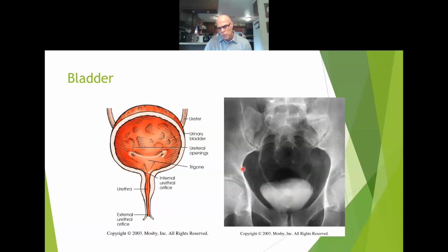So that's what your image would look like. It'd be about 3 inches above that. So you'd be centered right there, and you'd get this entire obturator foramen. The outlet and inlet of the pelvis right here that holds the bladder. You'd have all that, plus you'd have the bladder in the middle in case you have to throw in an additional bladder shot in with your positioning of the abdomens. I think that's it, guys.